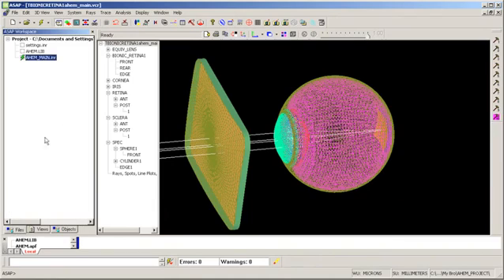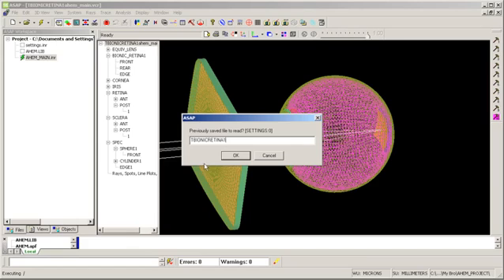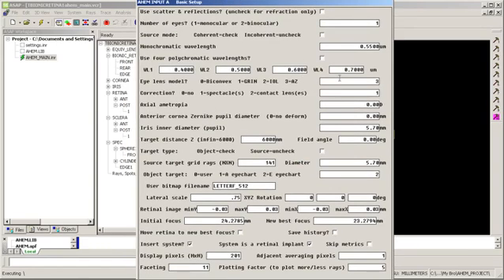So let's go ahead and use AHEM to set this up. I've got my Bionic Retina settings. Alright, so here's my first splash screen, and I've got a basic setup similar to the default model. However, when I get down to the bottom, I have an option to insert system, and a Bionic Retina is a system. But now it asks me, is a system a retinal implant? In this case it is, so I have that checked. I increased my faceting a bit so I could see the curvature a little better, and I click OK.